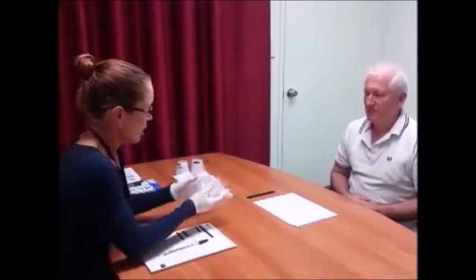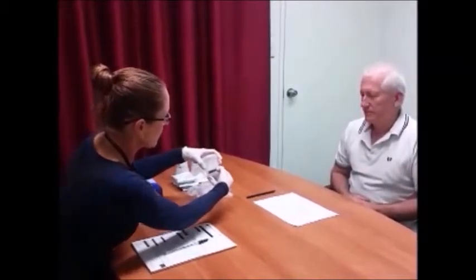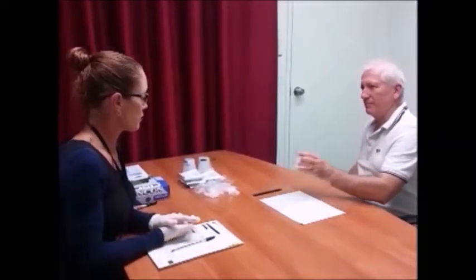Just documenting our collection site on the chain of custody and the date is 18/6 and the time. Okay, we're going to pop to the bathroom, but just a couple more instructions. All you need to get to in here is just above the temperature strip, okay? Yep. So you can grab that cup and we'll head off into the bathroom.